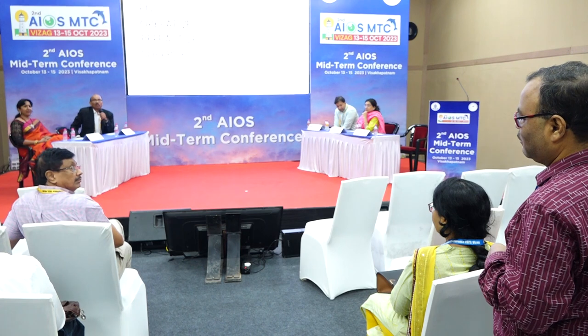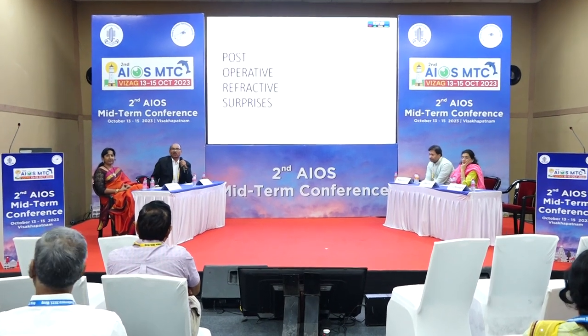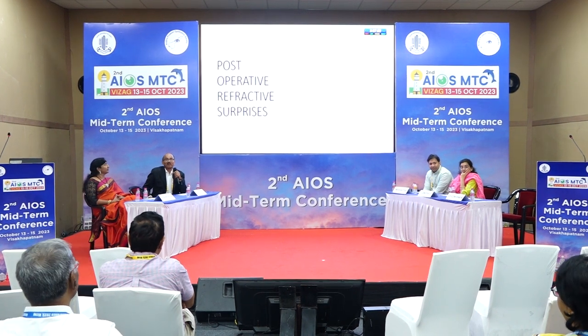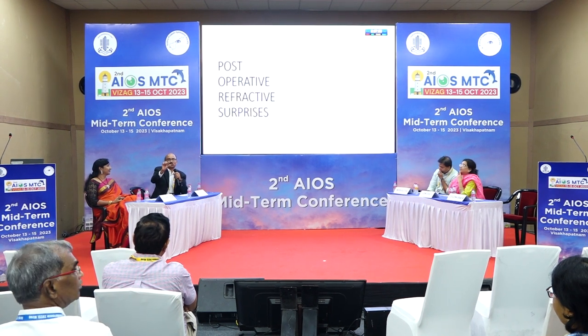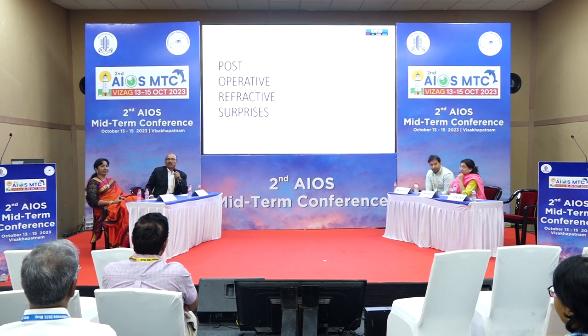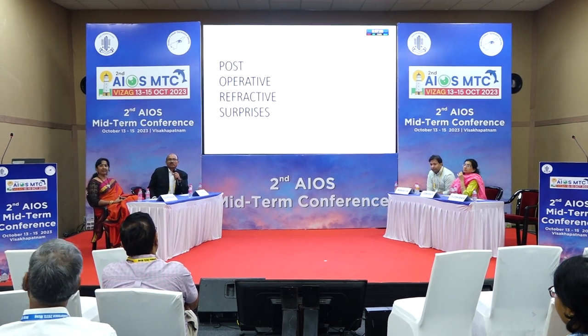Fibrin glue, instantaneously it will attach. But same day, you cannot keep it for the next day. Same day you have to complete. If you are a volume surgeon only, you can afford it, because it is 10,000 rupees. Reliseal also, same day, but 4,000 means that is half of the dose. But it is less effective than that of Baxter. You try both. But at least with 10 cases it is valuable, 10, 20 cases. Or share with your friend.